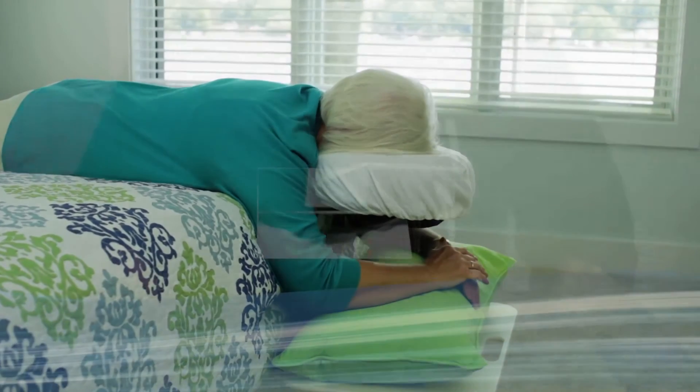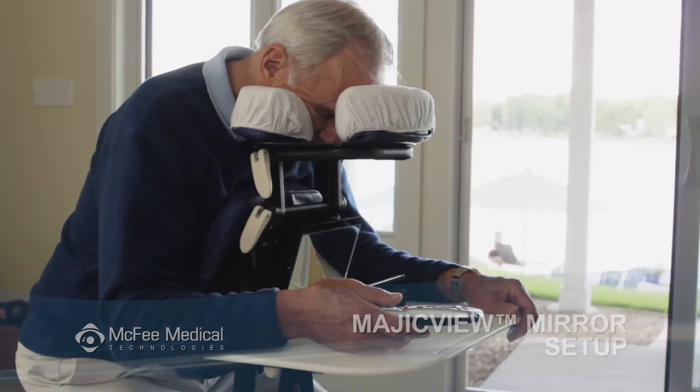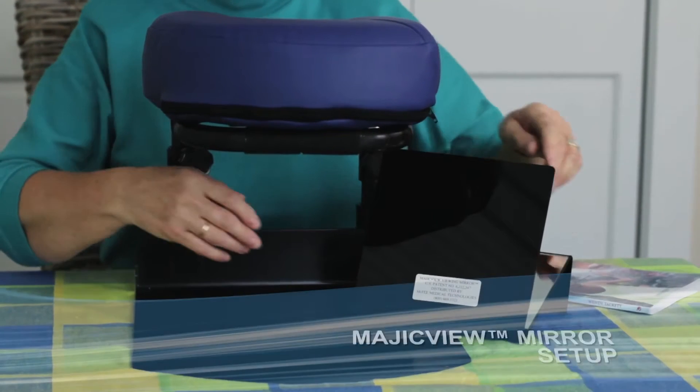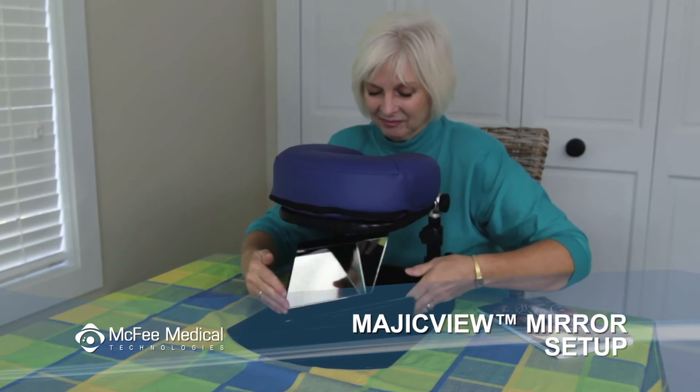The Magic View Mirror is used the same way with the easy sleep face support and seated support systems. Place the Magic View Mirror directly below your eyes with the slanted side — the side with the label — pointed inwards or towards you.